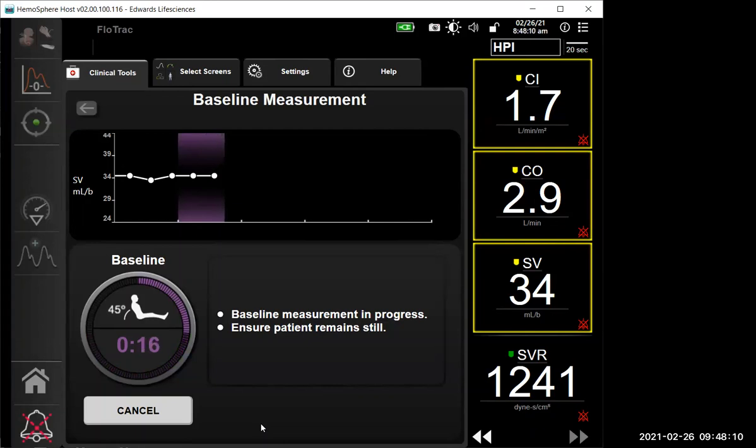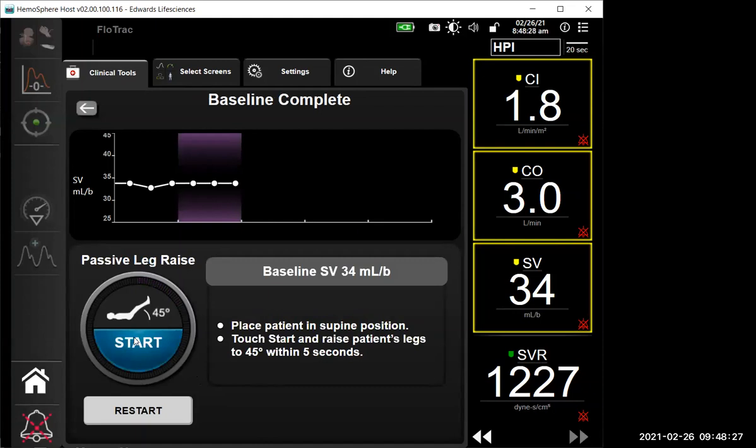Say your patient has an infection or they're trying to get rid of lines and you don't have a Swan, it's nice to wean Impellas. Same with a balloon pump, but you have to put your balloon pump on pause to get your numbers, just because it creates that bunny ear waveform and it's going to give you crazy numbers or none at all when you use it. So I'm gonna hit start.